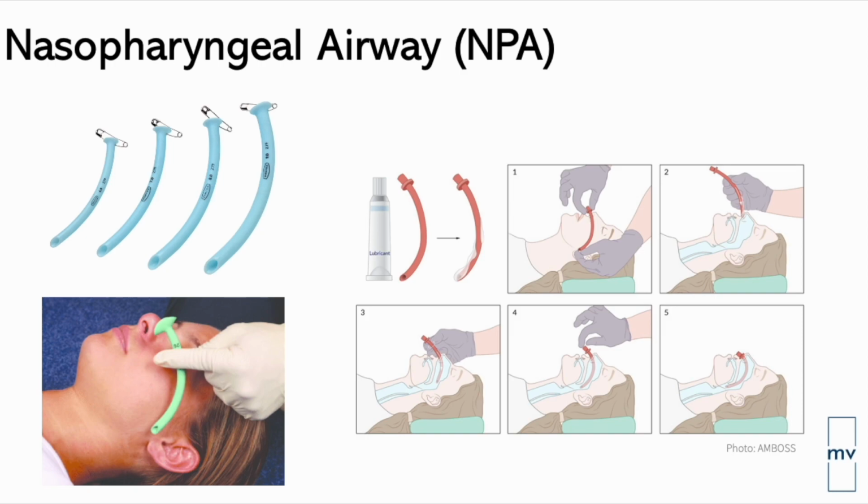Things to note with this one though is we can't use it for patients who have fractures or trauma at the base of their skull, of their facial bones, their midface, their nasopharynx, the roof of their mouth. Just because we would be prodding and poking into an area that is sensitive. If we're blasting oxygen into it as well, we can also cause subcutaneous emphysema, and then we could potentially go intracranially as well if there's a fracture just at the base of the skull.